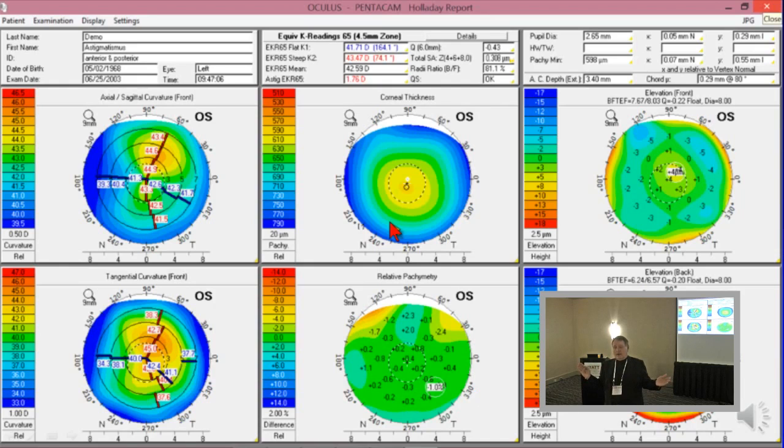it's not going to affect your result because they all have the same average power, and so it's not going to make any difference which one of those you use. And if you look down in that 2 millimeter zone is 1 diopter flatter than the 4.5 millimeter zone, okay, then you know he's got a multifocal cornea that's flattest in the center. And that if you use that 2 millimeter zone and use that flattest K that you get, you'll never ever have a hyperopic surprise.